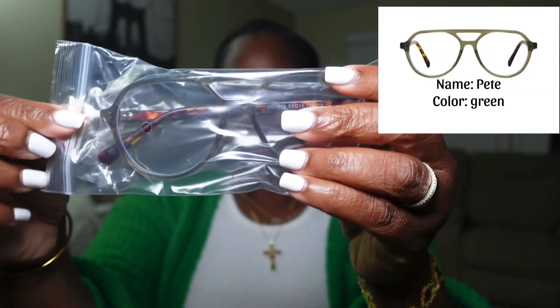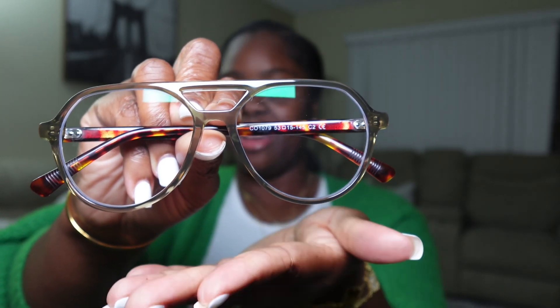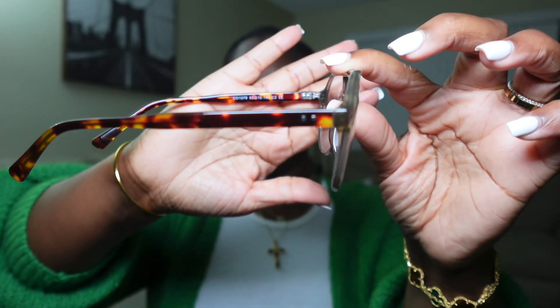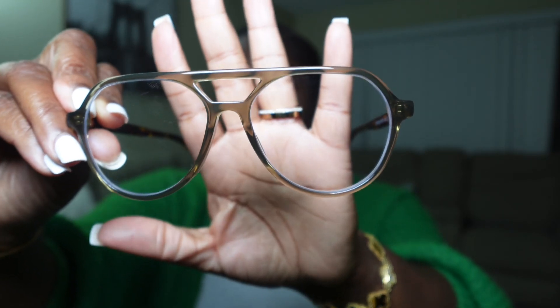This one should have been the last one — I would just end the video here, but it is not! On to the next one. This last one is also branded — I'm just gonna open it and get into it. Another cleaning cloth. Here are the glasses. Take it out, take it off. This one has a light, light green tint, and when you open it, this is what the angle is giving. Love the shape of this one.